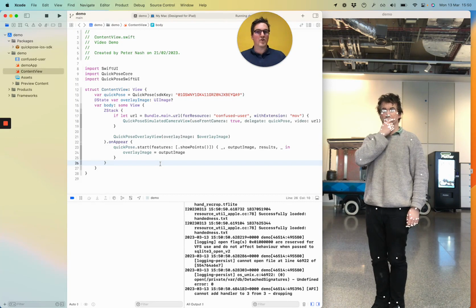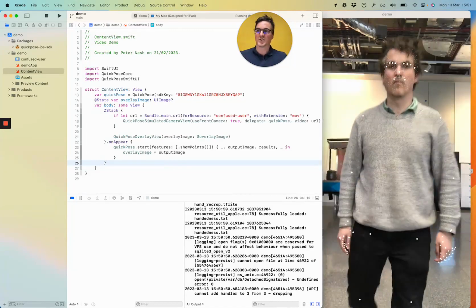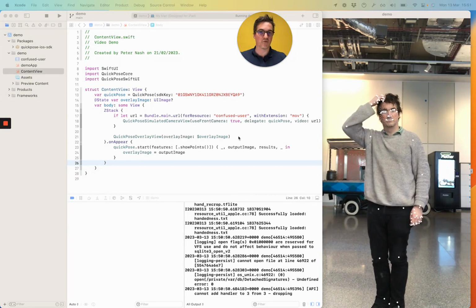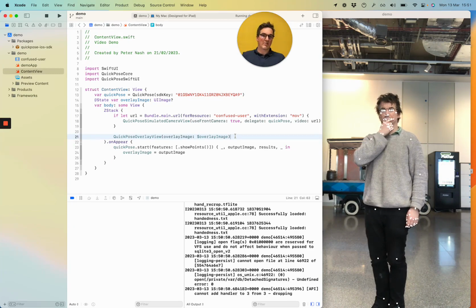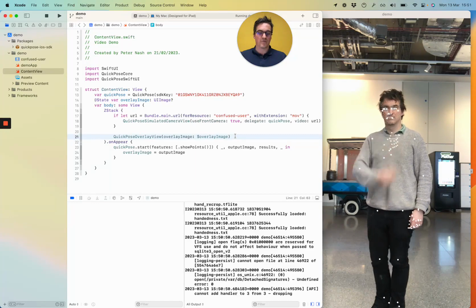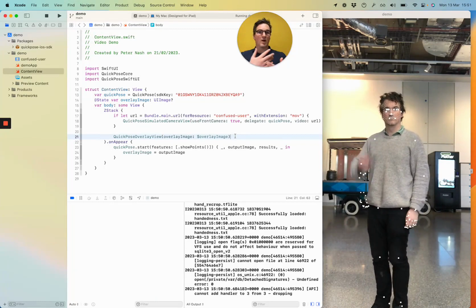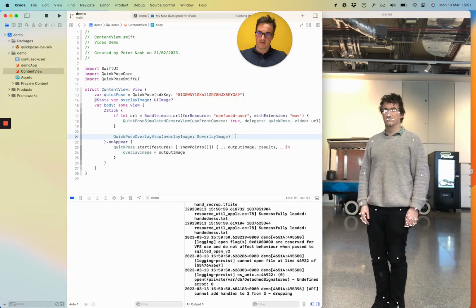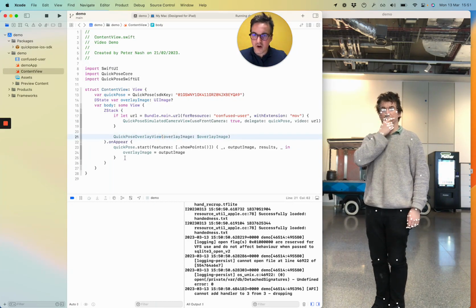Okay, so we've got a confused user. That's sort of to be expected because there's no UI prompts at all. So I think what I'll do first is just put in a prompt to say something like raise your leg or welcome to the application, because the goal here is to make a range of motion measurement app, but we also need a lot of UI prompting and a lot of feedback. Otherwise the user won't really know what to do.